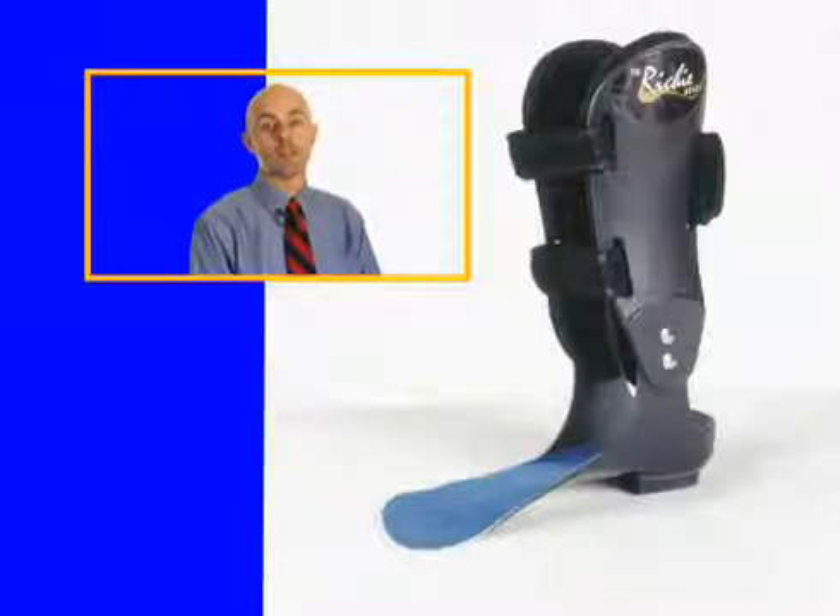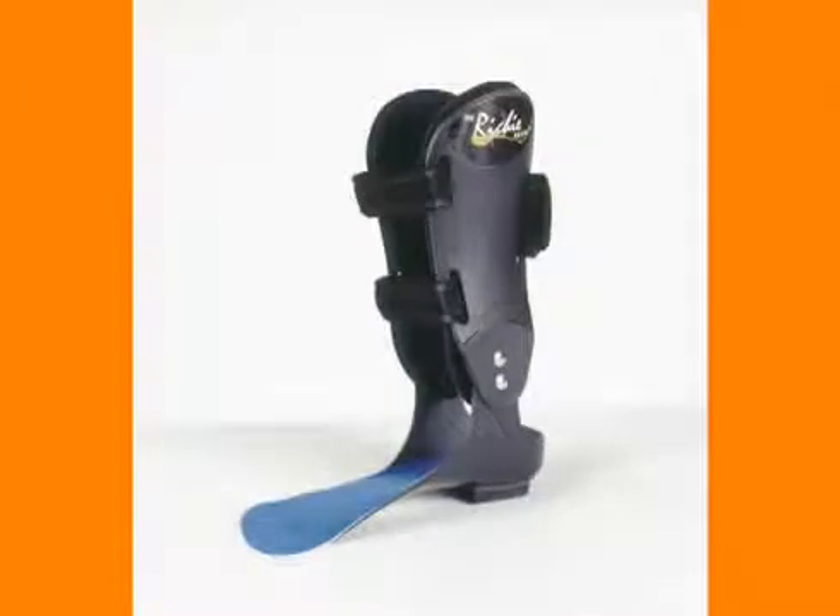It consists of two primary components. It is a balanced, custom, fully functional foot orthotic with high SMO trim lines with medial and lateral clips and deep heel cup. This is then connected to two uprights. It is designed to control motion above and below the ankle joint.